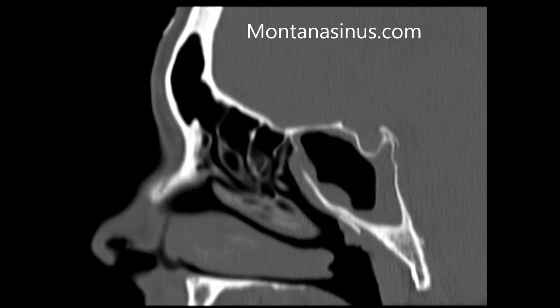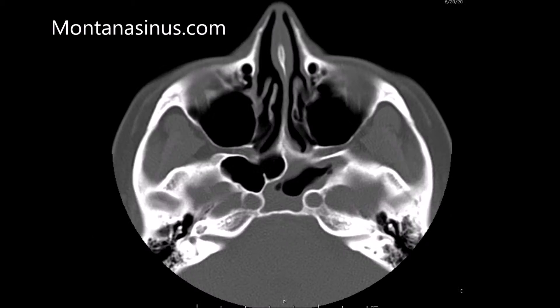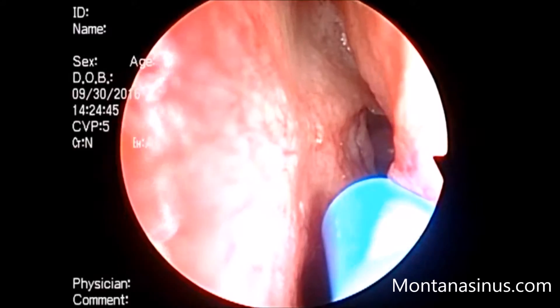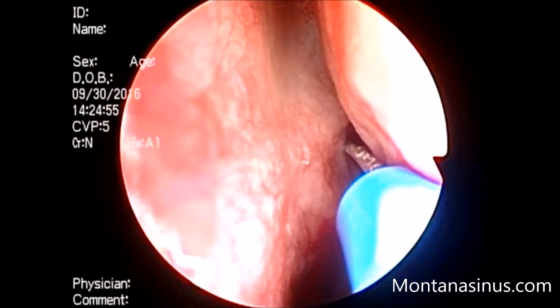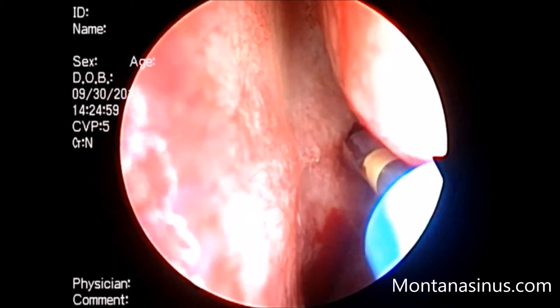The sinus involved is the left sphenoid sinus. The video has been edited to be as short as possible. The video starts with a close-up of the guide wire entering the sphenoid sinus after the opening has already been dilated once.